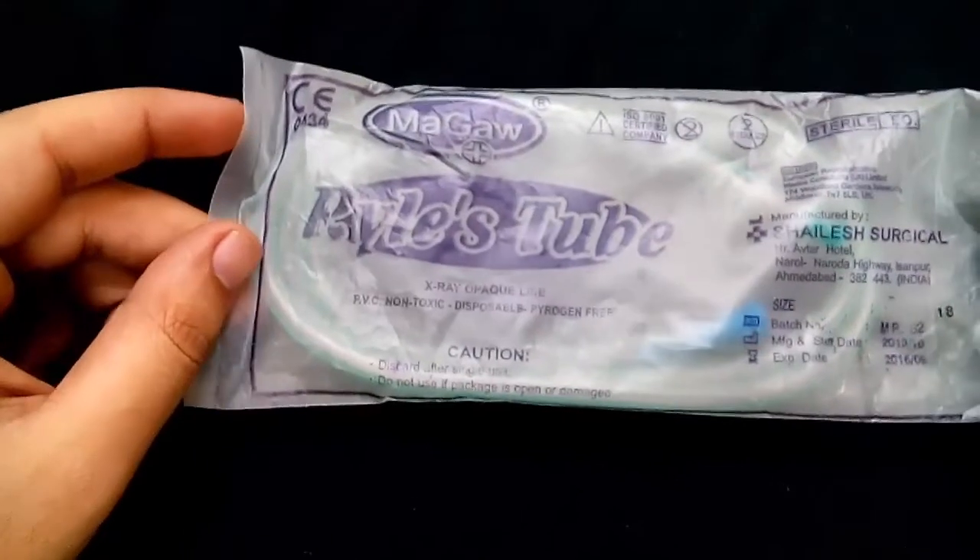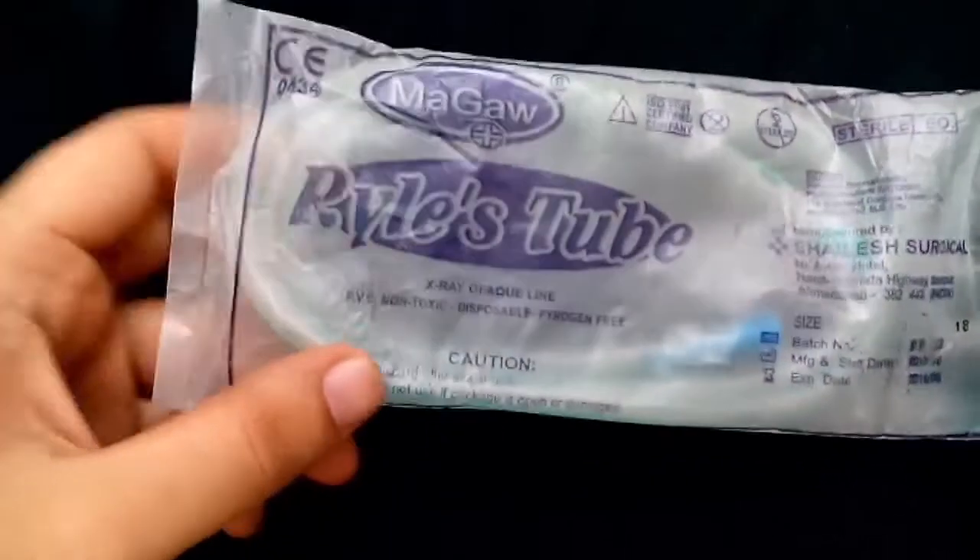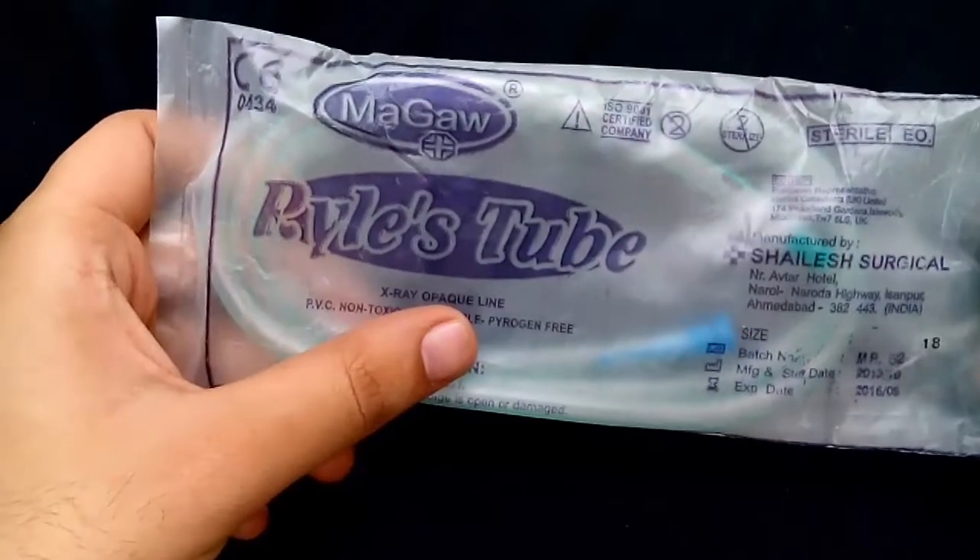This is Riles tube, also called nasogastric tube. Nowadays plastic Riles tubes are available which are made up of polyvinyl chloride, and these are disposable.